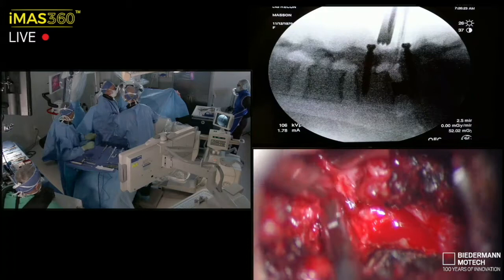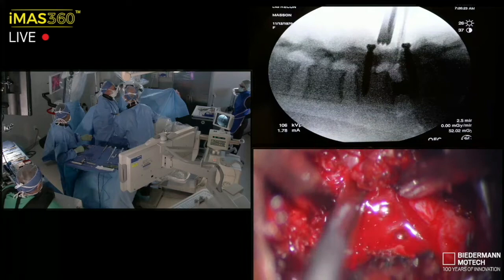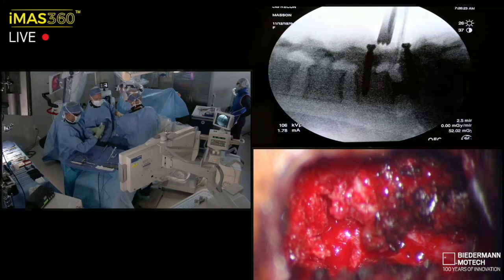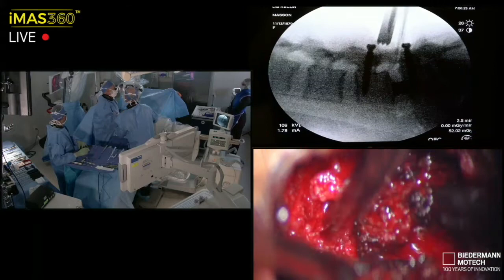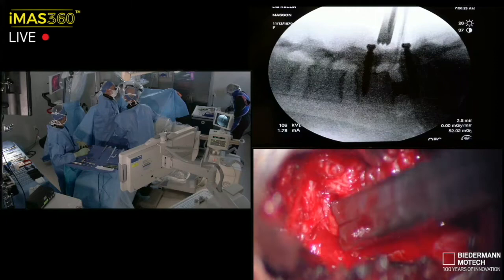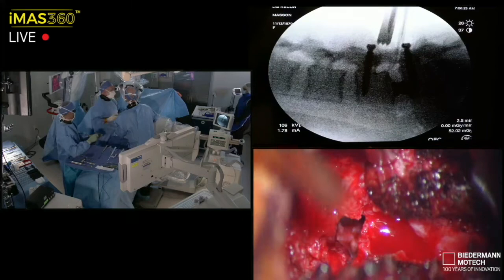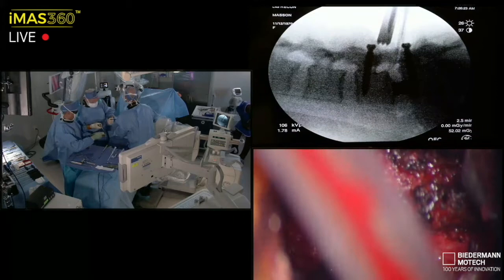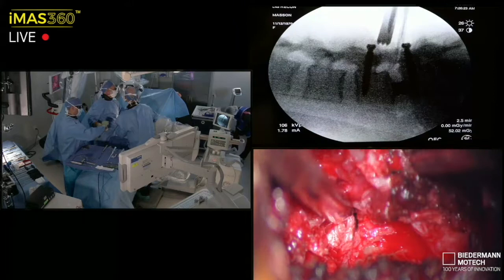Now, as you can see, I mean, I personally, you know, I said it before, the easy part of the case is done. This is the hardest part of advanced segmental reconstructive spine surgery, is doing thorough, adequate, safe, minimally invasive decompressions. And so it's a huge advantage to making the other stuff easy. So we're cleaning out the disc space at 4-5 behind where we put our TLIF. So that alleviates some of the ventral compression. Let me go up by them.